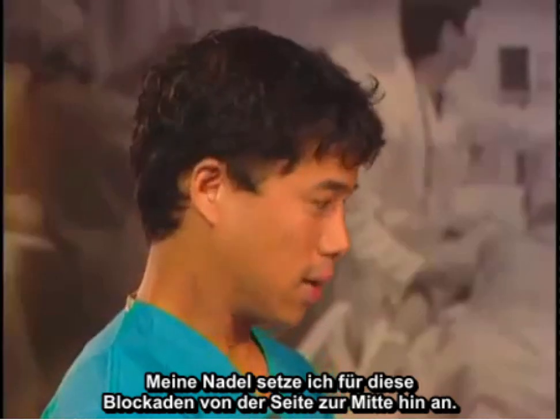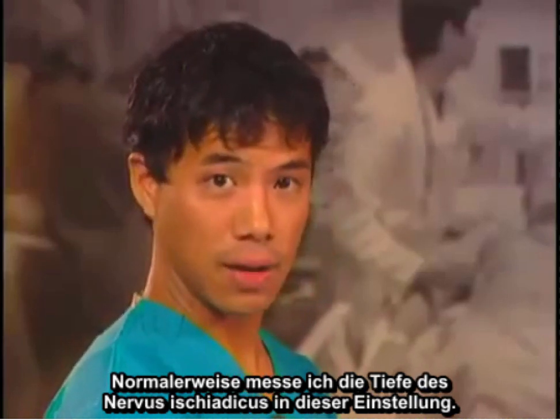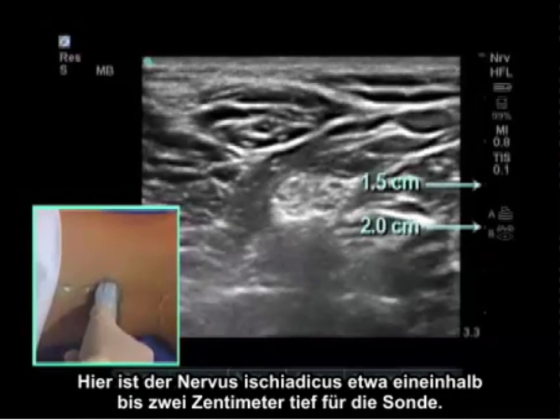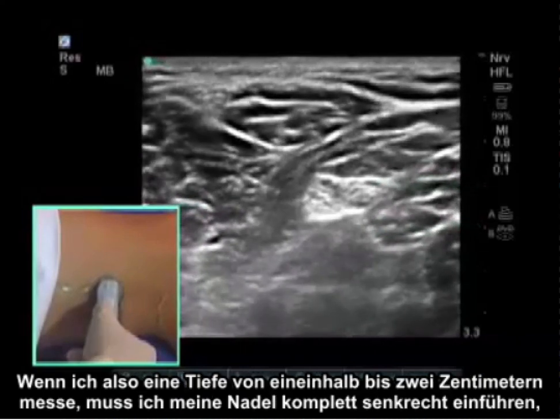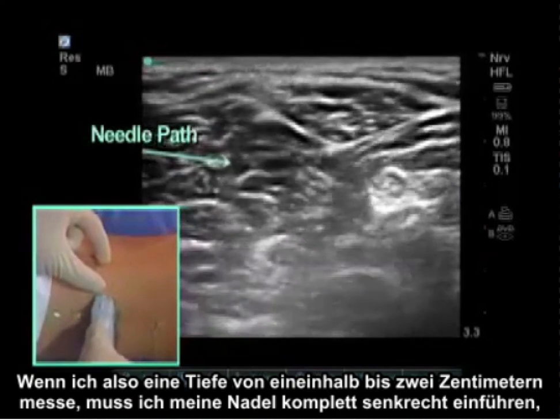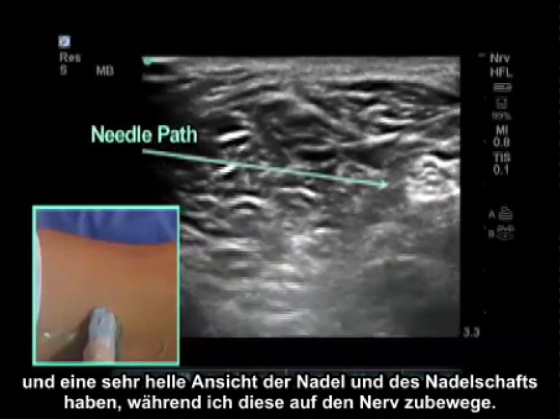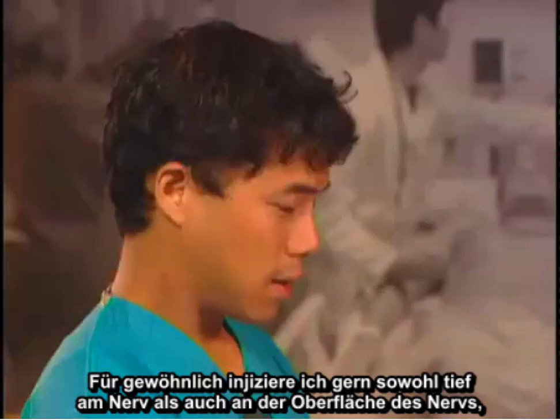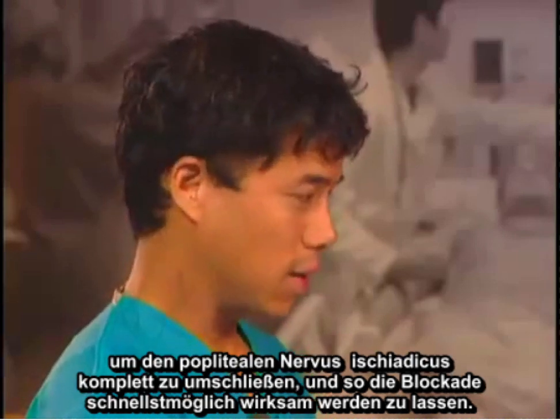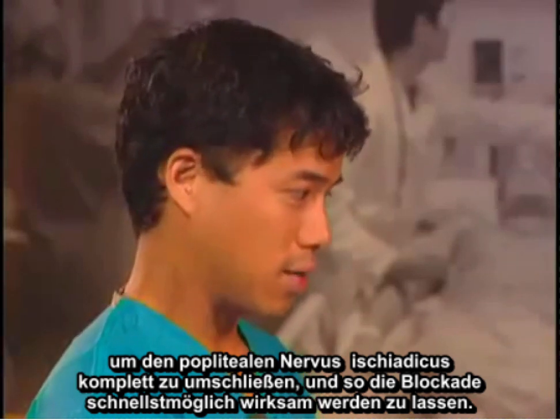My needle approach for these blocks is going to be from lateral to medial. I typically measure the depth of the sciatic nerve — here it is approximately one and a half to two centimeters deep to the probe. So with the needle coming in completely perpendicular, we get a very bright view of the needle and needle shaft as it advances to the nerve. I typically inject deep to the nerve as well as superficial to the nerve in order to get complete surrounding of the popliteal sciatic nerve for the most rapid onset.